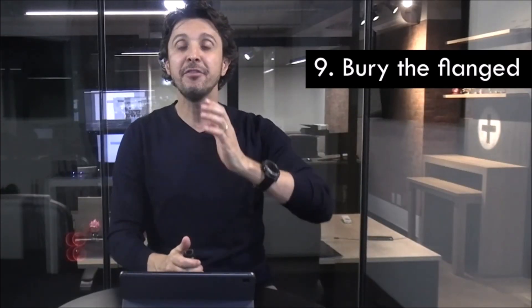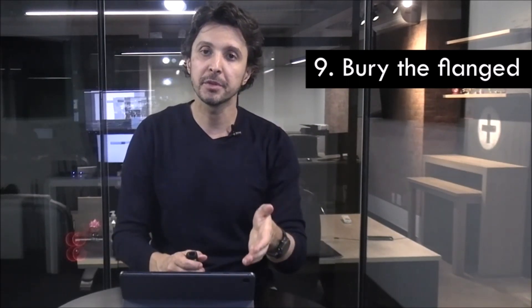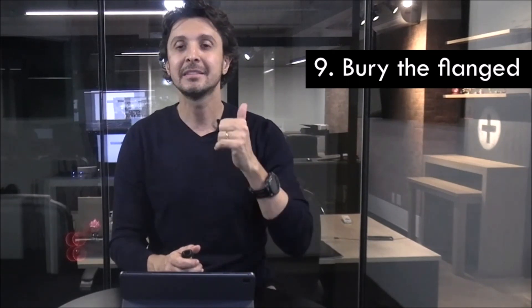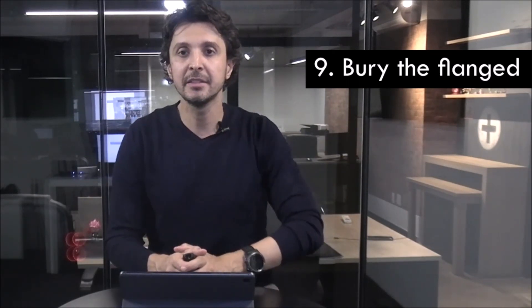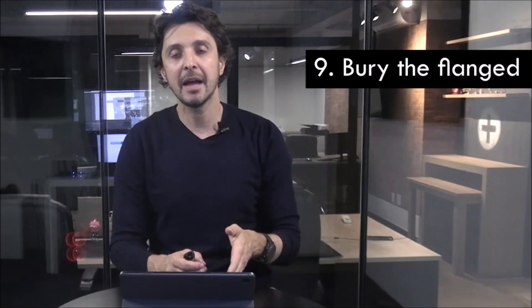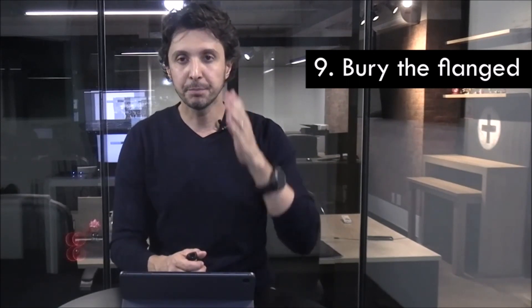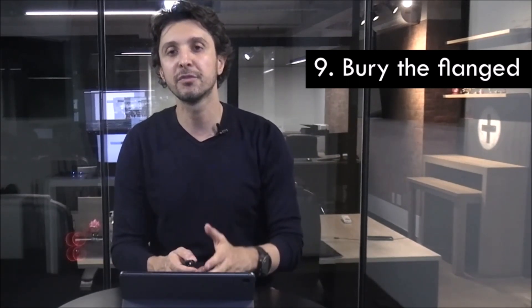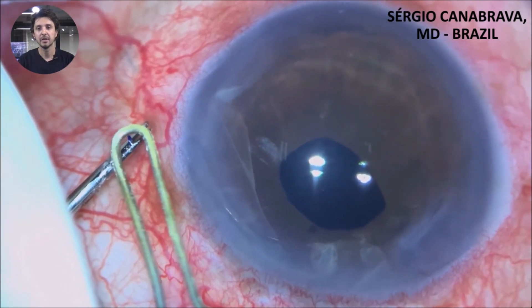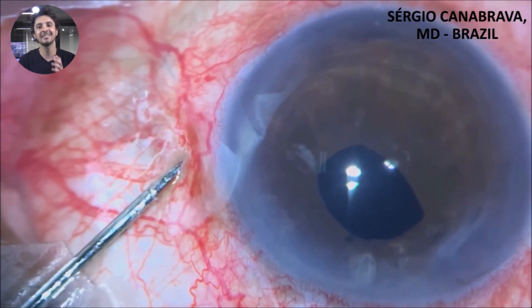Tip 9: bury the flange inside the scleral tunnel. It is very important to avoid flange exposure and to avoid epithelial damage. If you can read the last September editorial from the JCRS, edited by Liliana Werner, you can see how these tips I am discussing here are addressed in that editorial. It is so important to avoid flange exposure and epithelial damage. Observe this video — look at the size of the flange as I use the micro forceps to insert the flange inside the scleral tunnel.